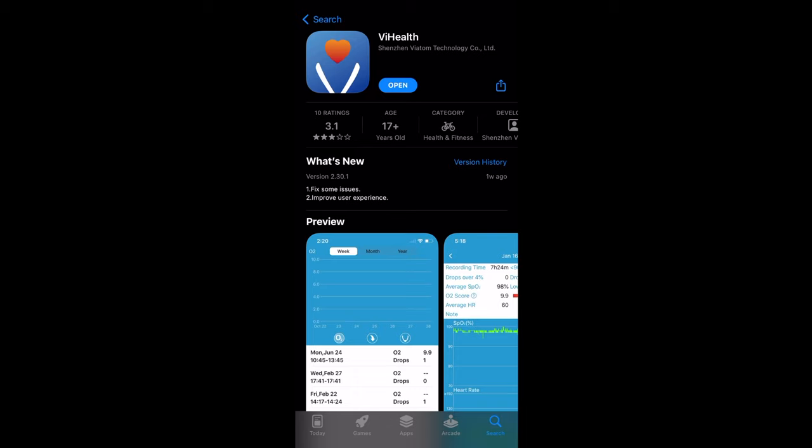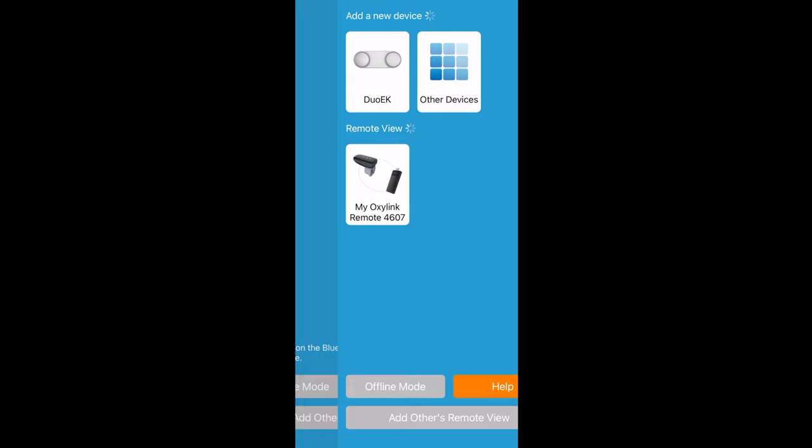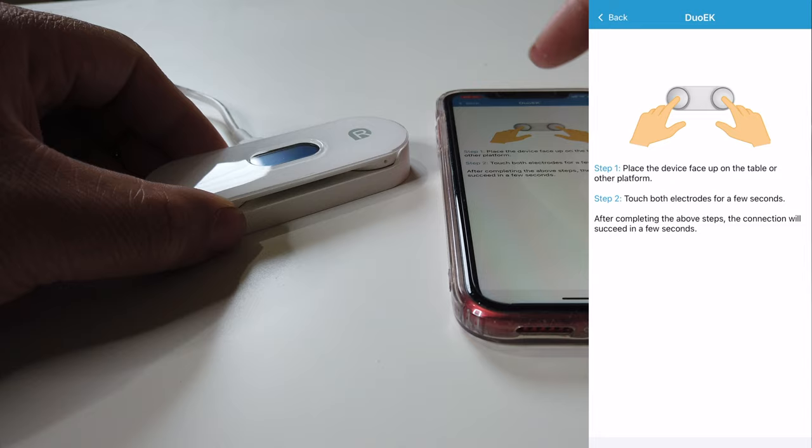The first thing we need to do is download the ViHealth app. Make sure to register and sign in as well to verify your device. Then we're just gonna pair the new device to our phone. We're gonna click here — as you can see it's already seeing our new device. It's called DuoEK, so we're just gonna click that and set it up.